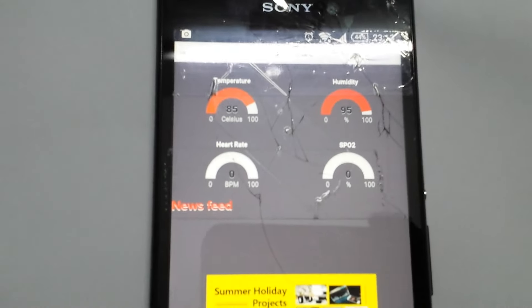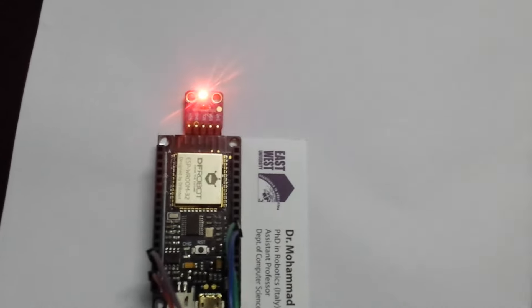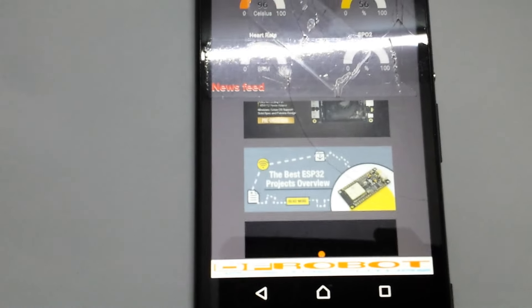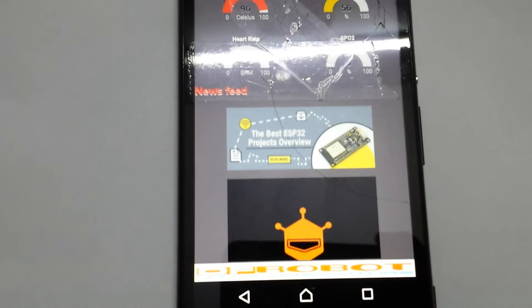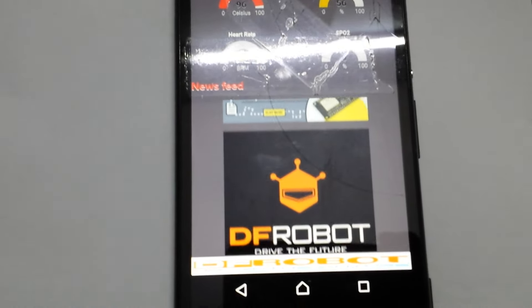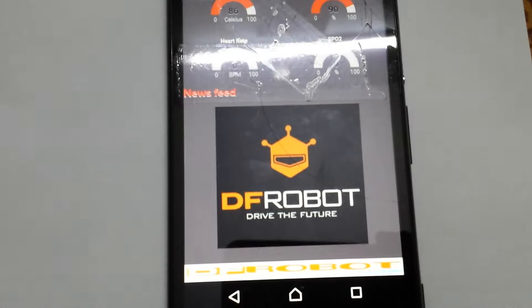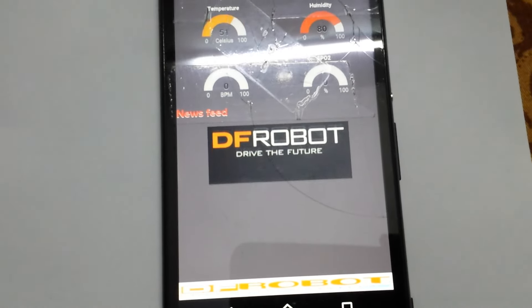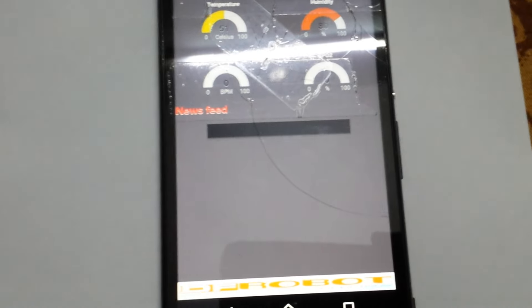...is zero because I lifted my finger from the sensor. There's some DFRobot news feeds and their logos. Let's check it again.